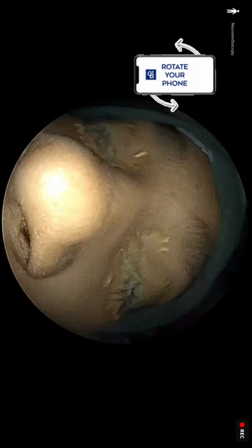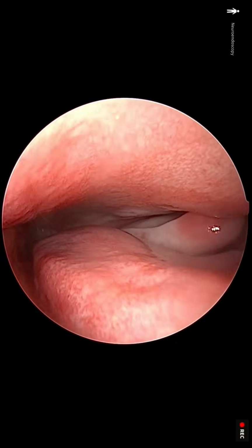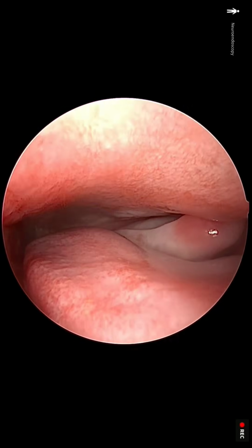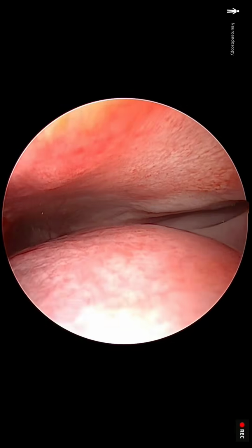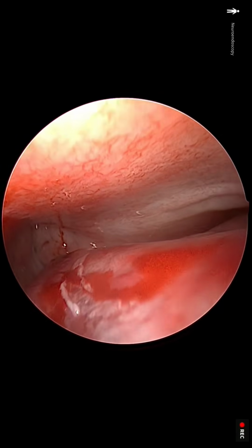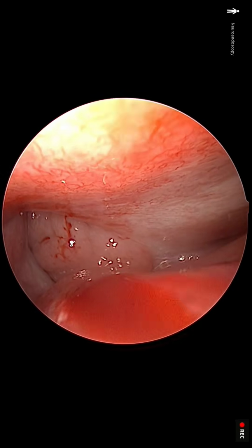This is a child 7 years in age. I'm showing you the patient's left side nasal cavity on the screen's right and the inferior aspect. You can see a tubular structure here. This is called the inferior turbinate, and that is usually an erectile tissue. So when the patient is exposed to the allergies outside, this swells up and kind of blocks the nose almost completely.